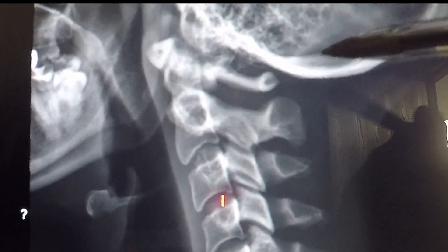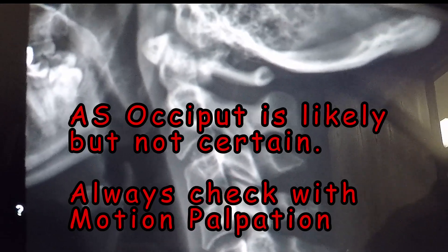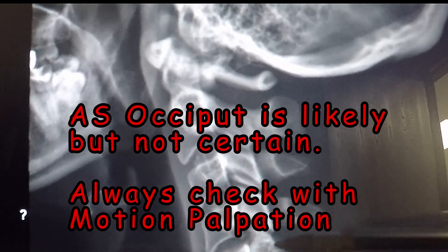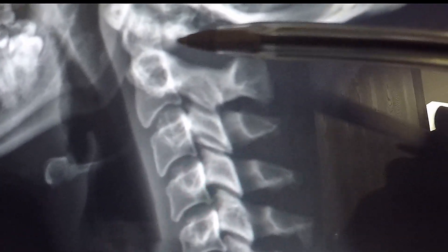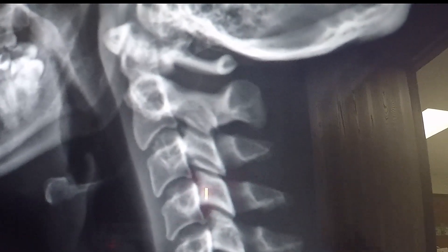One of the interesting things about this is look how cramped the atlas bone is to the occiput. This patient came in and said that they had pretty tremendous headaches. So it's very likely we're going to be adjusting an anterior occiput here, as well as staying below that injury site where ligament instability occurs — I'll probably be adjusting her C6. As a general rule this works very well. That's what a military neck looks like and how you can see it on an x-ray.